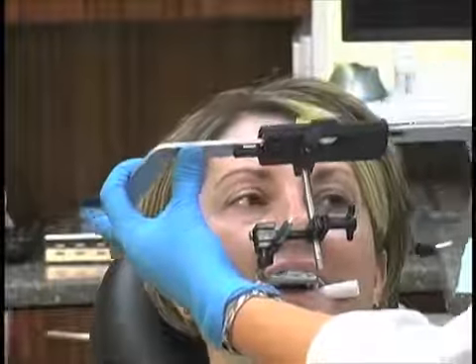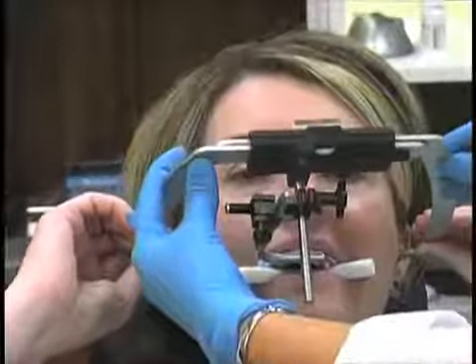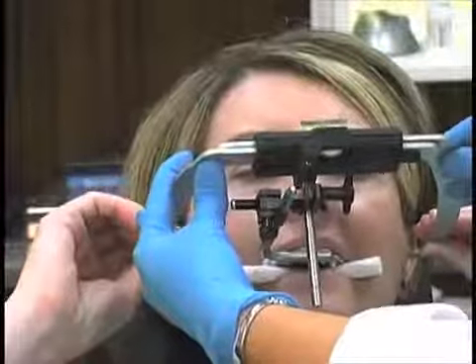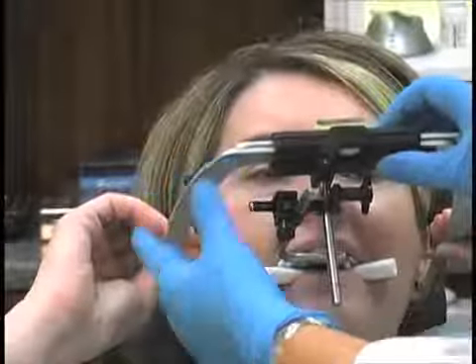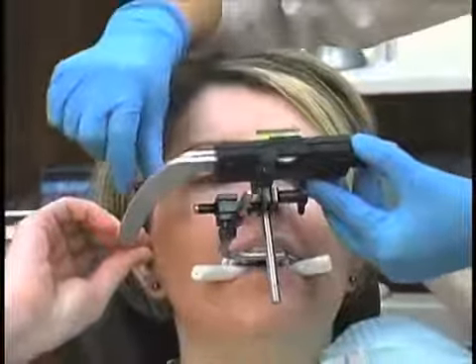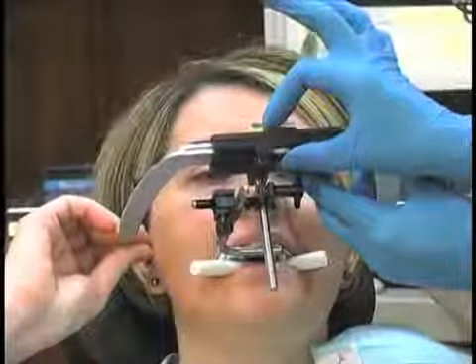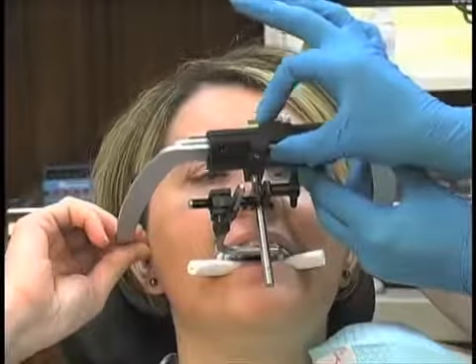And we're going to have the patient help us here by guiding the Facebow into their ears. Now notice what's happened here is the Facebow is now on their face, and the bite fork is attached to the maxillary arch, and so we have some of the basics here.